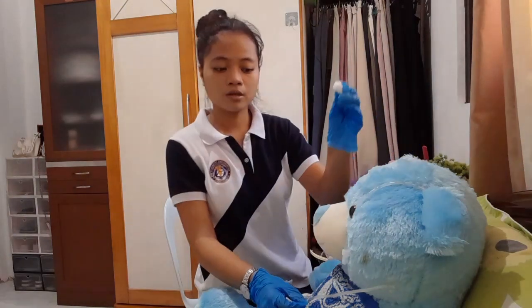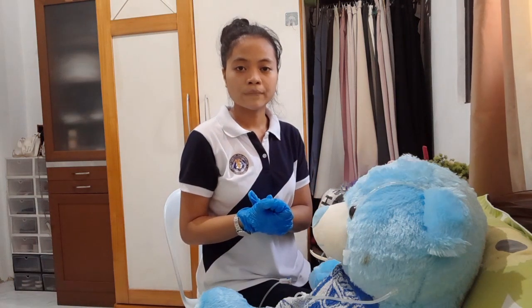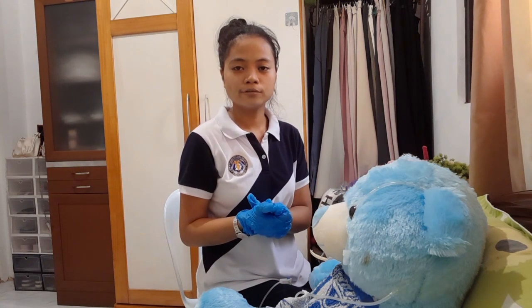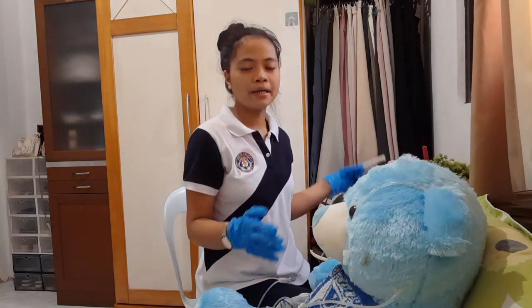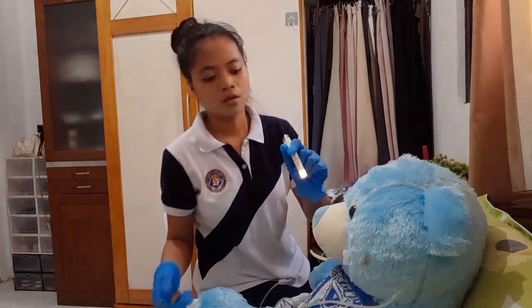Then next is to cleanse and dry the bridge of the nose and apply skin protection. So we're going to cleanse the bridge of the nose. Then after that, we're now going to examine the nostrils for deformity or obstruction by closing the one nostril and then the other, and asking the client to breathe through the nose.